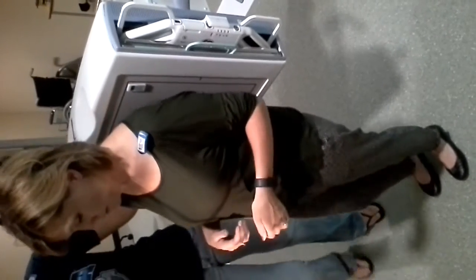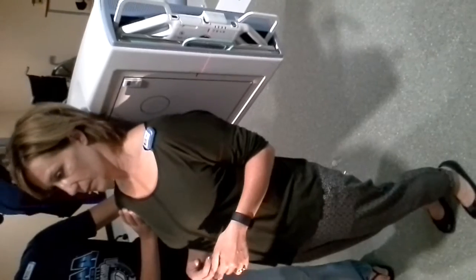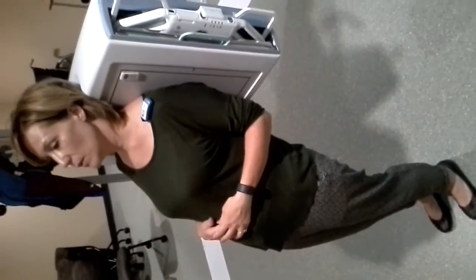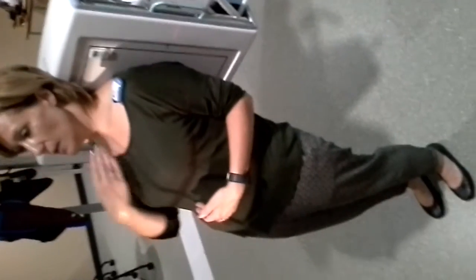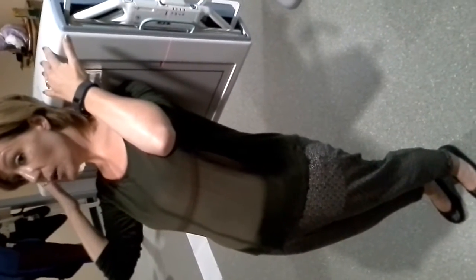Go ahead, take a little step forward. Same thing. Go ahead and lean back. Almost there. Okay. How does it look on my shoulders now? Good. Okay. So now you want to look to make sure that it's centered. Am I centered side to side? Is that right about in the middle? Yep. I've got my head rested right in that little dip on the wall bucky, so it does work well for this view.